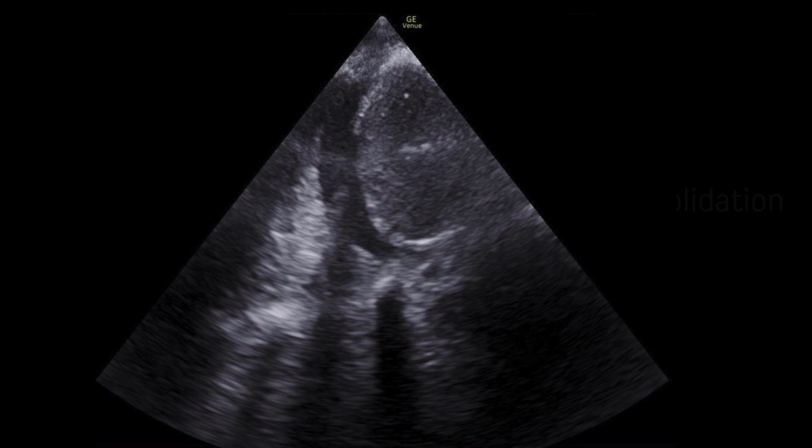Yeah. Okay. So pleural fluid. So this is obviously an organ, be it the spleen or the liver, and then that's pleural fluid, and you've got the lung there. So that also, if you think about it, your trauma patient, if there's pleural fluid there from trauma, whether he has an X-ray or not, he needs a chest drain because there's blood in there that needs to come out. So that helps with that. Then you can rather just get the X-ray afterwards.